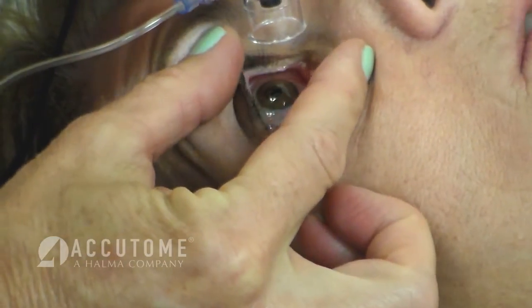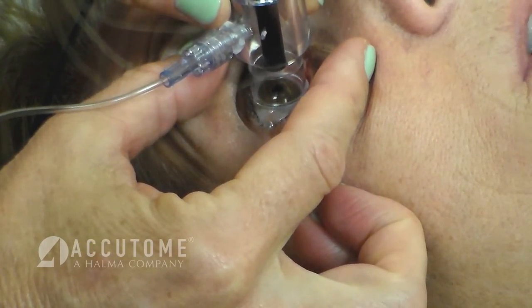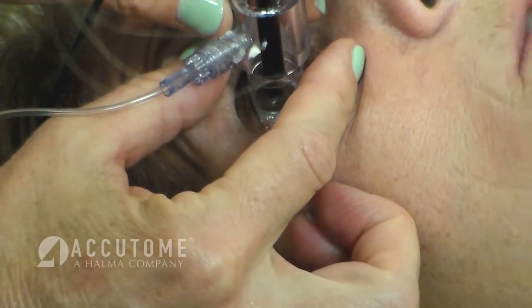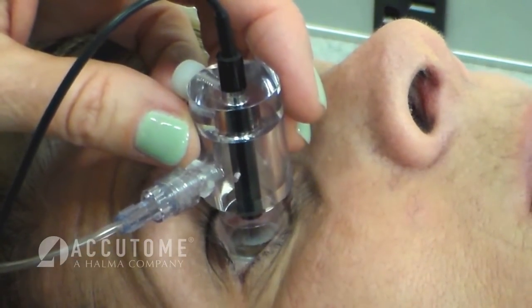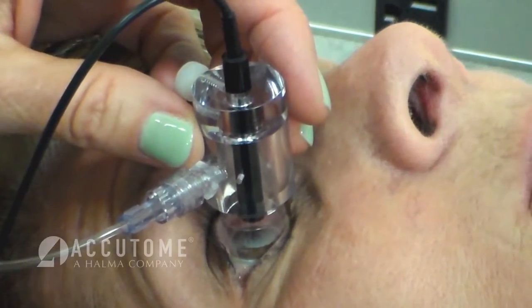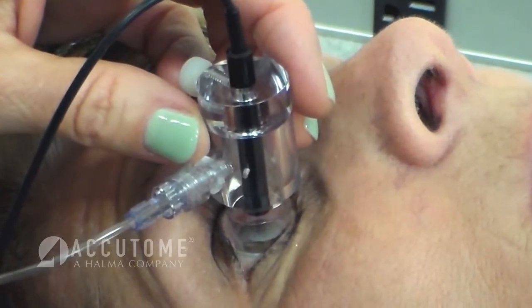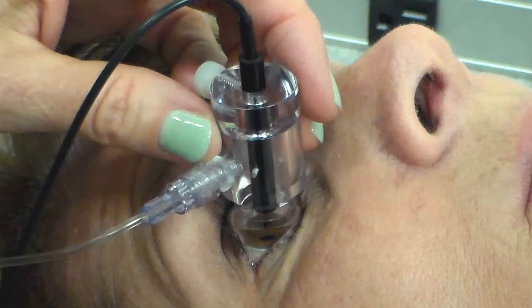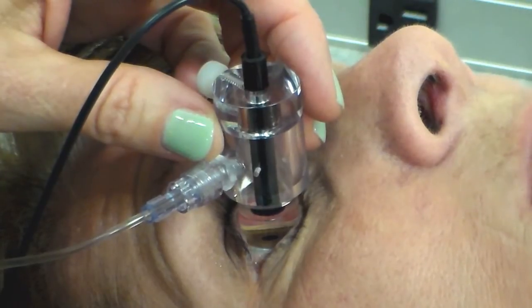With the patient reclined, ask them to fixate at a target on the ceiling and gently place the immersion shell into the patient's eye between the lids, ensuring that the shell is properly placed on the sclera and has no contact with the cornea. Once the shell is in place, release the upper and lower lids, allowing them to form a seal with the shell which retains the balanced salt solution and does not allow leakage. Press and hold the foot pedal and gently squeeze the balanced salt solution bottle until the fluid in the shell reaches the probe and a waveform appears on the computer screen.